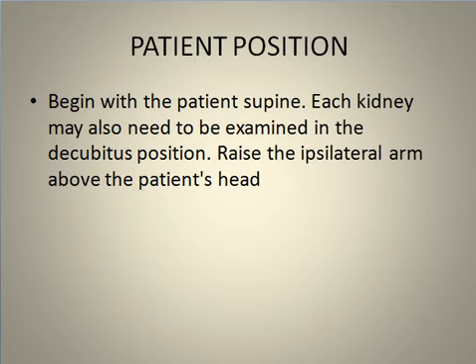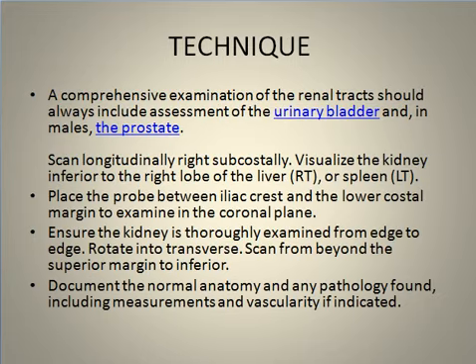We start in supine position, and sometimes we can also do the decubitus position. Sometimes we can do the patient in a prone position. We should also do a comprehensive examination of the urinary tract, including the prostate in male patient.